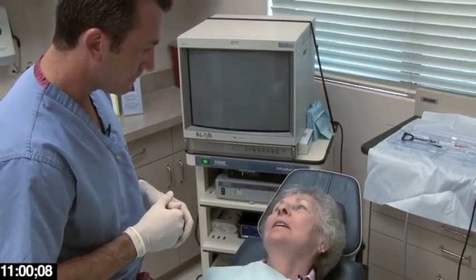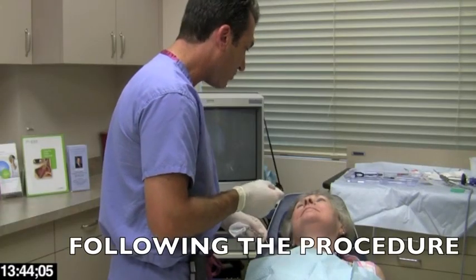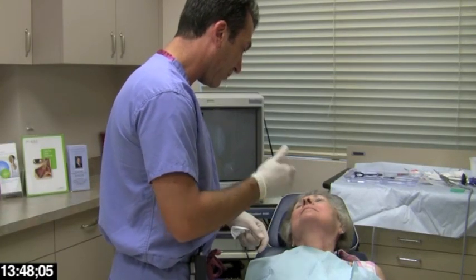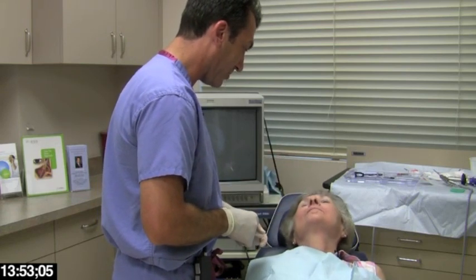The patient noted she didn't feel anything going in. Because the size of the puncture is so small, and the way that the lip sort of curls on itself in that location, we don't even need to put a stitch — it just heals up on its own.